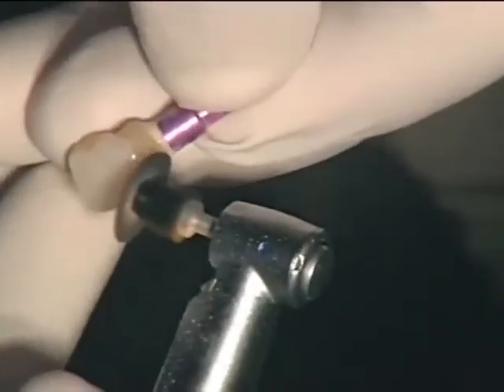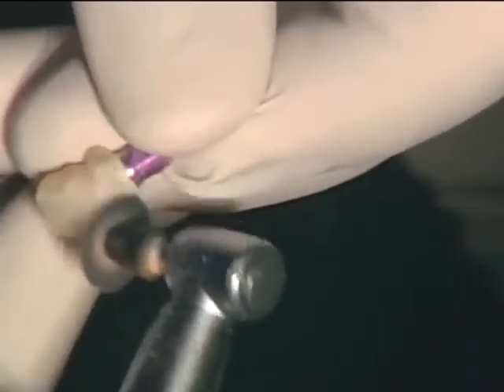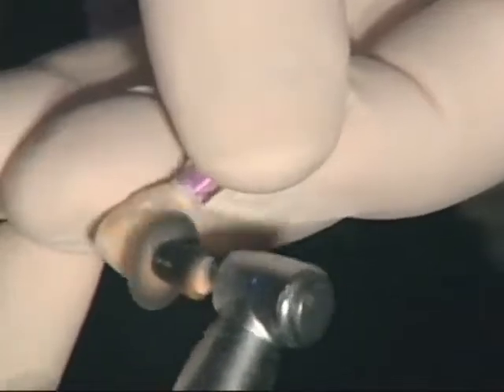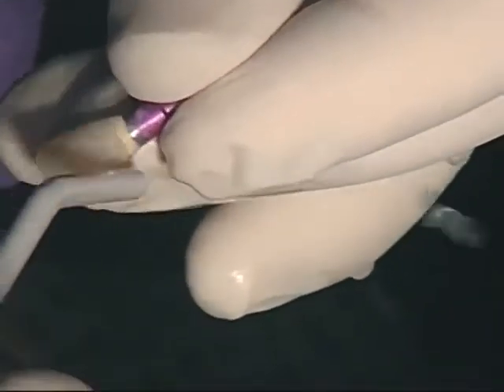What we also did is we made a second temporary with the patient's natural existing tooth that was removed. So we used our temp stent for one temporary, and showing the fact that we can make it either way. And then also with the index itself that we took prior to tooth removal, we have our second provisional, which is the one we will use, which is her existing tooth shell that was prepared in the same fashion, hollowed out, and retrofitting the margins back.